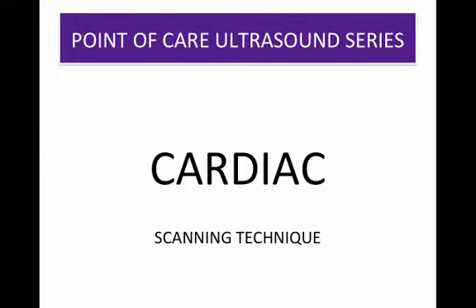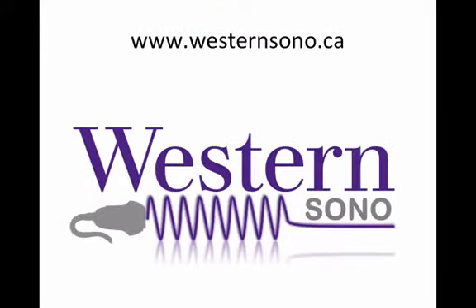We would like to welcome you to this installment of our Practical Point of Care Ultrasound series, with the focus of this module being the bedside cardiac ultrasound, limited to detection of pericardial effusion and cardiac standstill. As in previous modules, we will concentrate on the practical aspects of generating a good cardiac study, with many more screencasts on various topics being available from our selection at www.westernsono.ca.